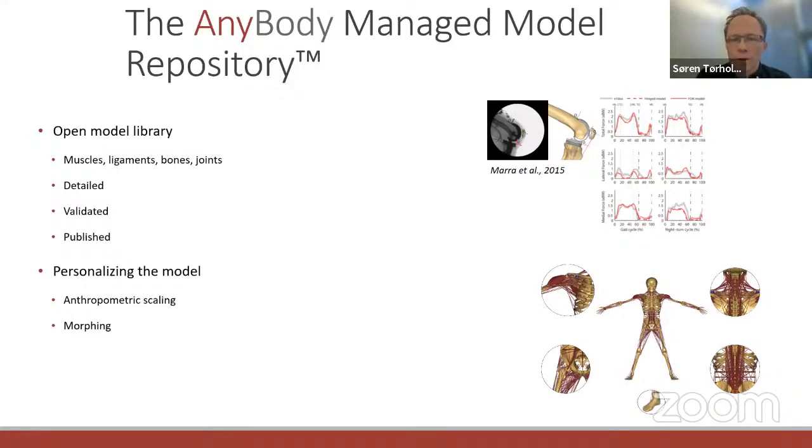Naturally, this is a very sophisticated kind of model validation, and not something that can be done in everyday life, because this data is difficult to get. So usually what you can do is compare predicted muscle activation against the measured EMG.